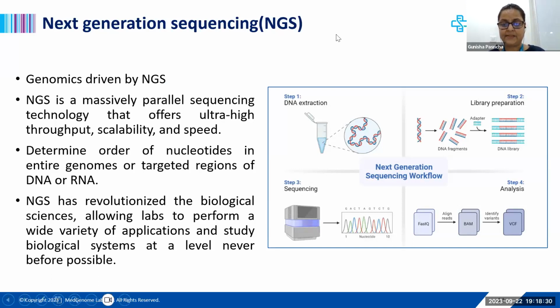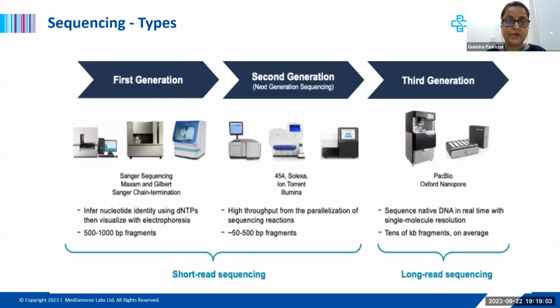So what are the basic steps? It involves DNA extraction directly from the clinical samples, and here we are talking about either whole blood or plasma sample in case of sepsis or bloodstream infection. The second step is library preparation. Basically, DNA fragmentation is done, adapters and indexes are put, not getting into technicalities of that. And then it goes into the sequencers, and the analysis is done, which in case of sepsis needs a proper bioinformatic pipeline. The validation is absolutely important. I'll take you through that.